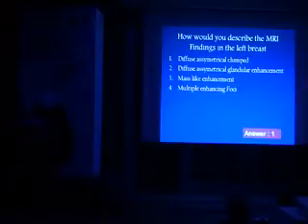But, so what's really of value? Are we just going to write down the description and finish? No, we have to have a differential diagnosis, a list of differential diagnoses. If we are now having diffuse asymmetrical and clumped enhancement, we always think of DCIS, as I said.